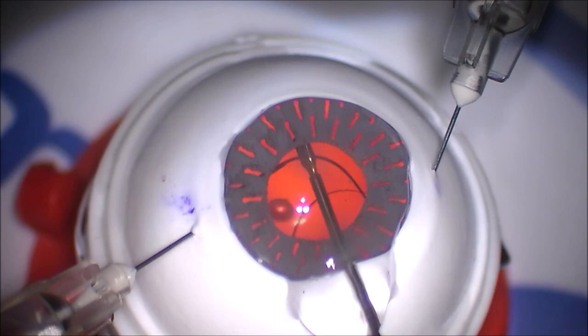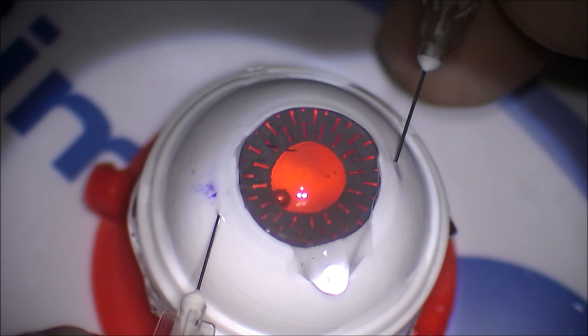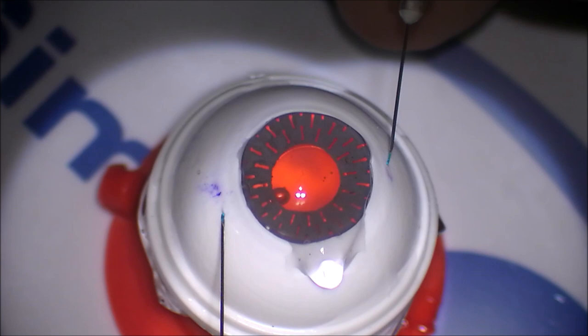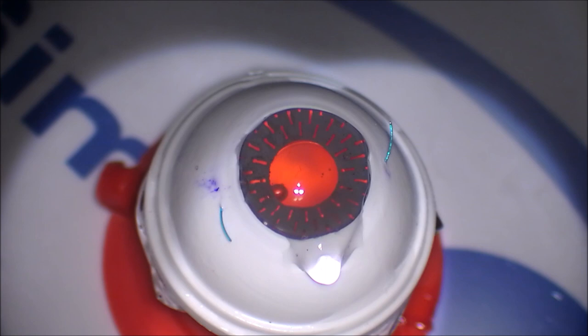And then I'm going to pull the needles out. I'm pulling towards me on the left side and away from me on the right side, which is in the direction of the approach of the haptic when I pierce the needle through the sclera. And you can see that you have a perfectly positioned haptic and lens. You know this because the haptics are fairly flat to the sclera. That means you have a nice scleral shelf. If you don't have a good scleral shelf, you'll see that the haptic is actually pointed up towards the ceiling. And when you have that, that means it's a very bad positioning of the lens.